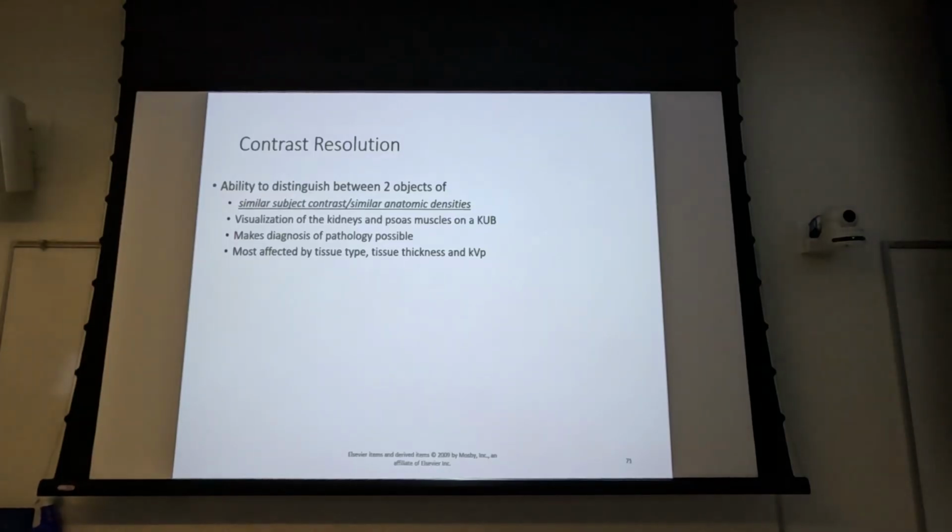And so sometimes we have a tendency to confuse even visually, like what we were talking about earlier in your presentation. You said this sharp image. Okay, well, what does that mean, right? In terms of radiographic sharpness, it's that spatial resolution.